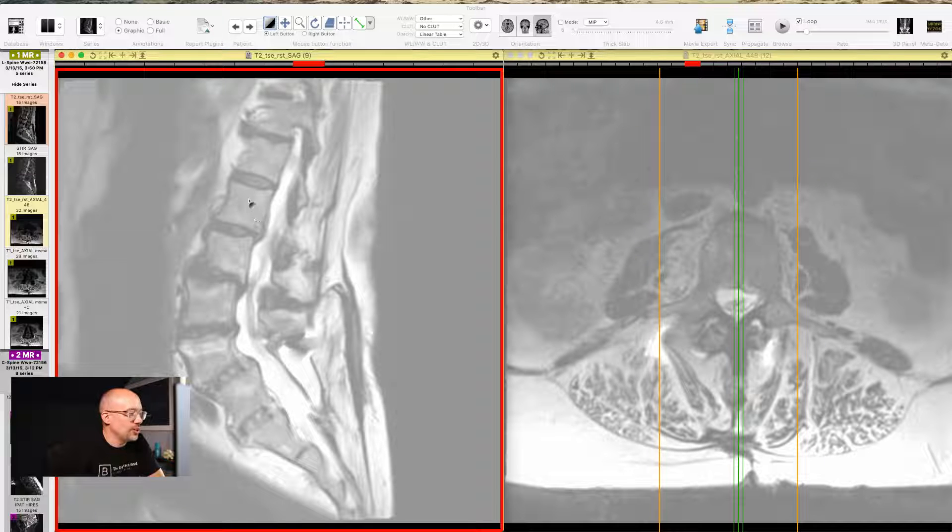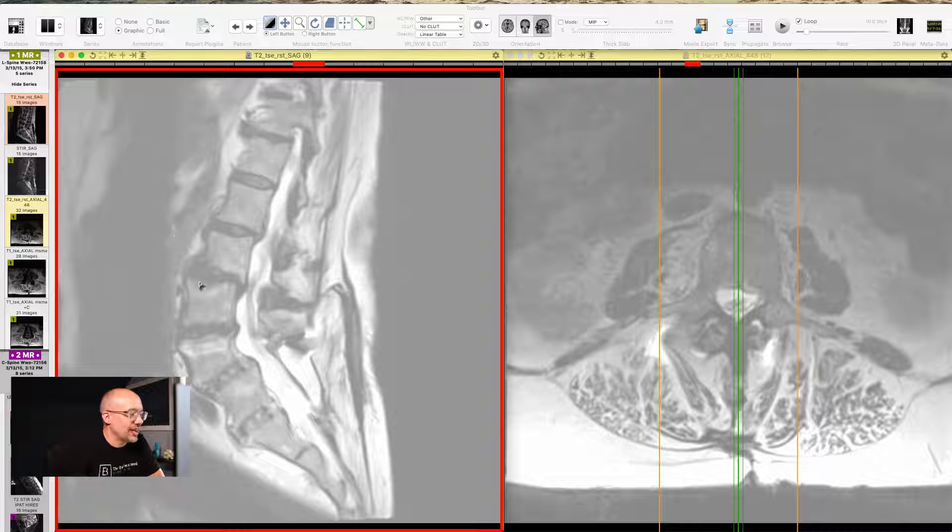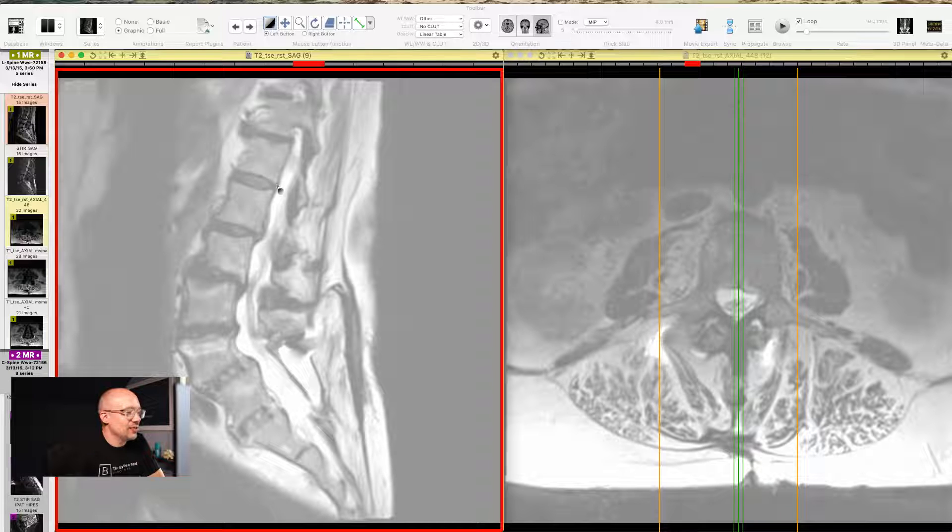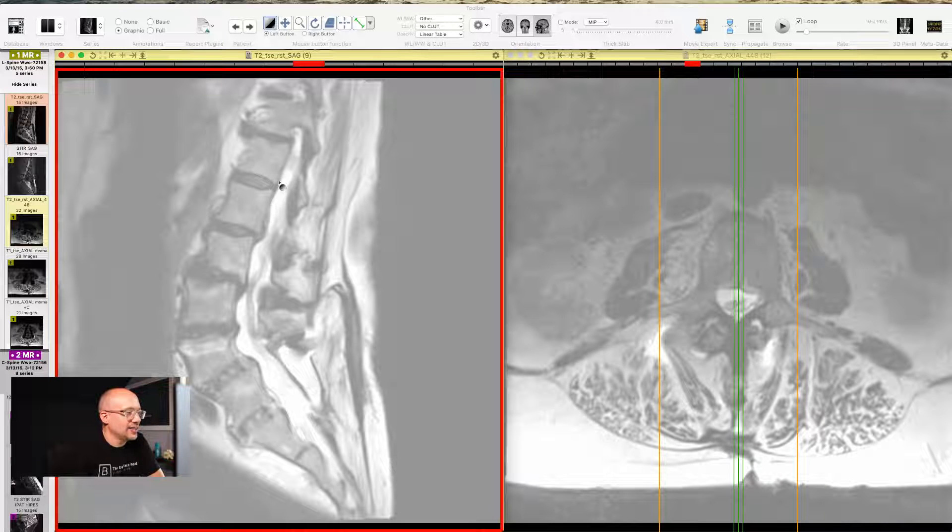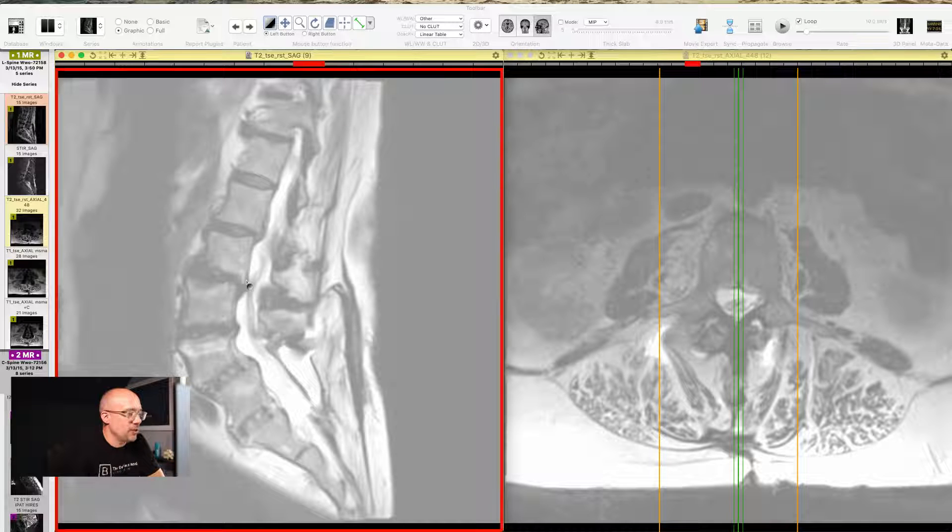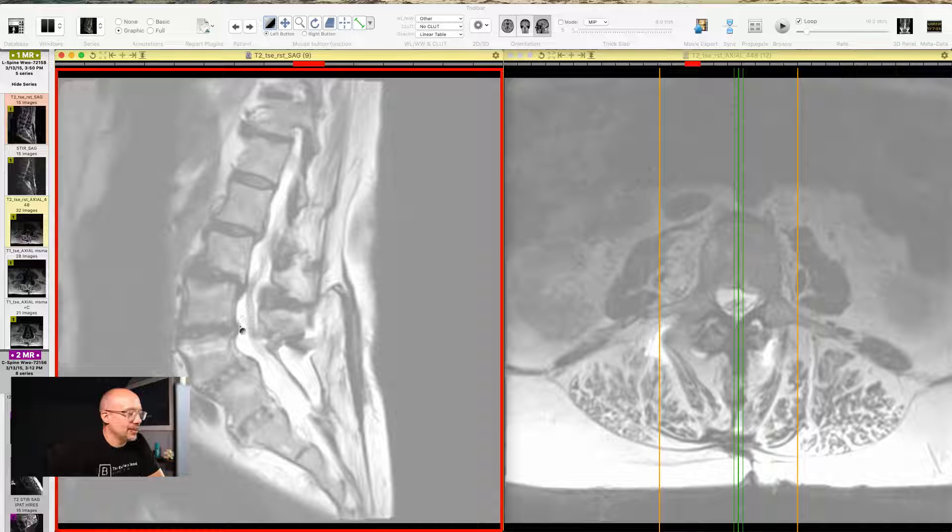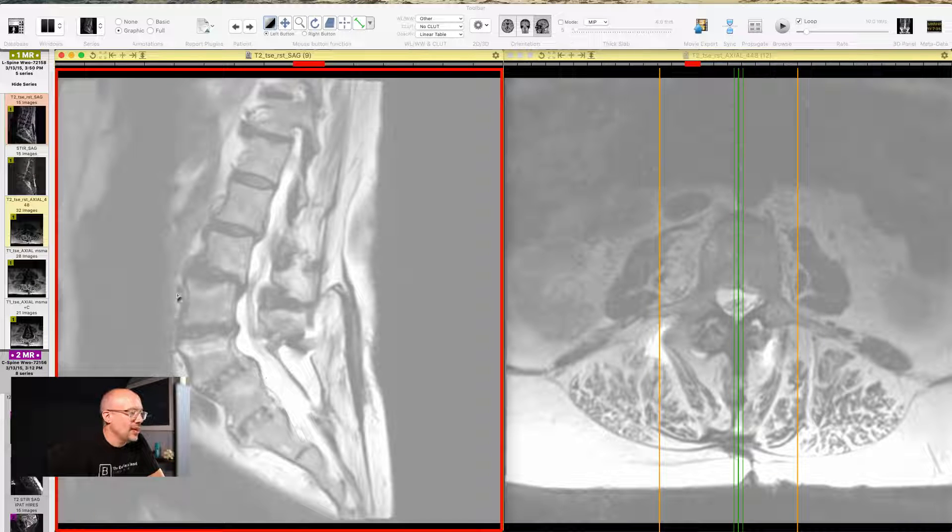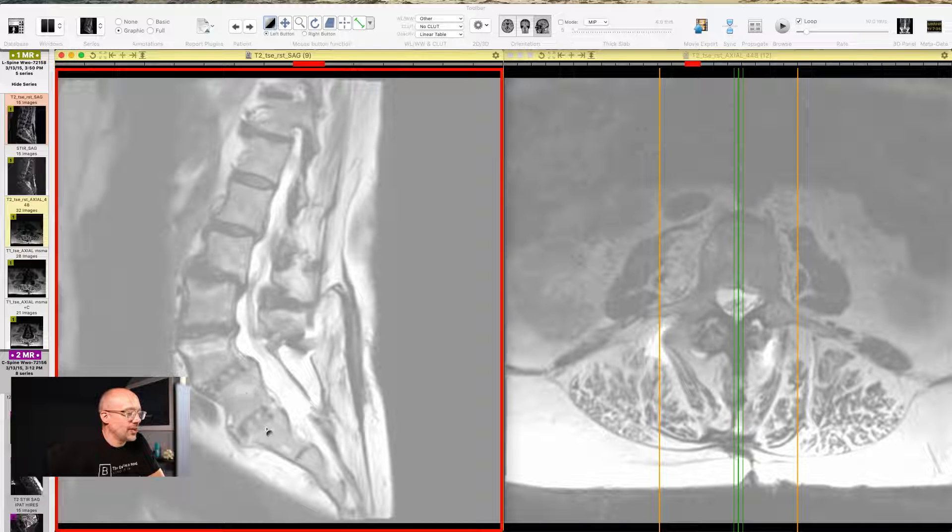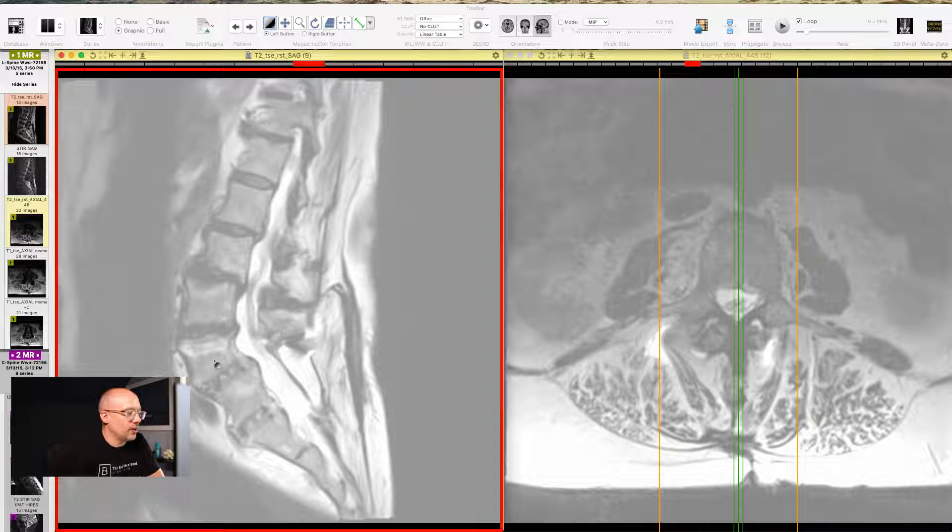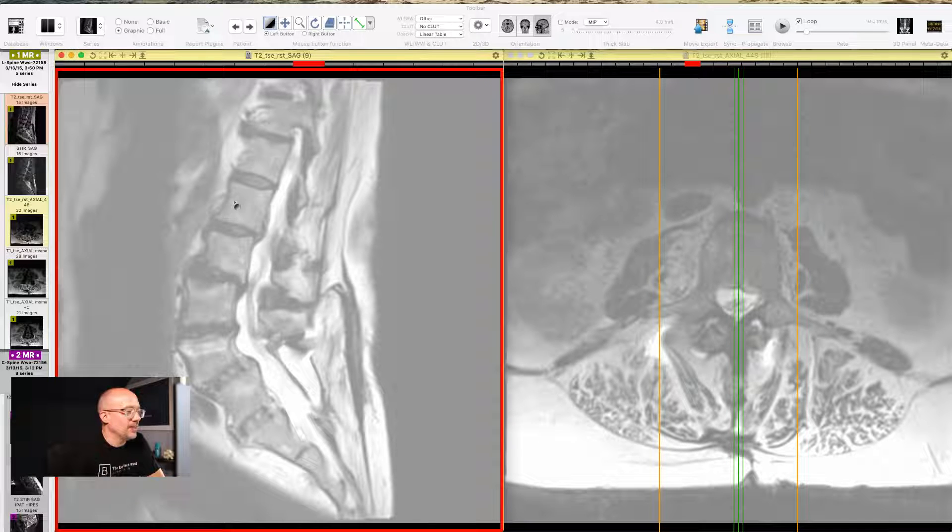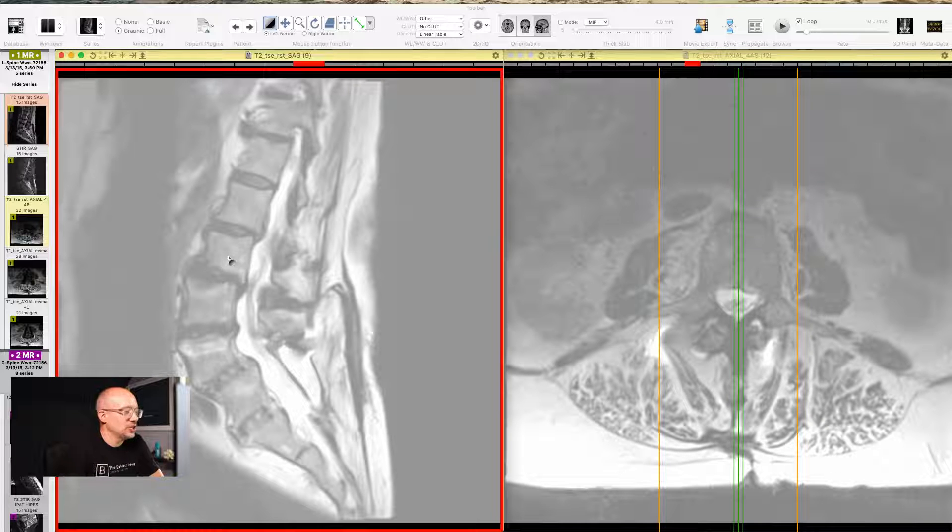Now one thing that you will notice as we go down is these things start to look sloppy and different. That disc, instead of residing nice and underneath the bone, we see multiple areas where the disc is poking out the backside. Look at those, I call them the beak, poking right out the backside and or out the front. So we have degenerative changes at L5-S1, L4-L5, L3-L2, L1-L2, and even T12-L1. So we had a lot of degenerative changes throughout the spine.